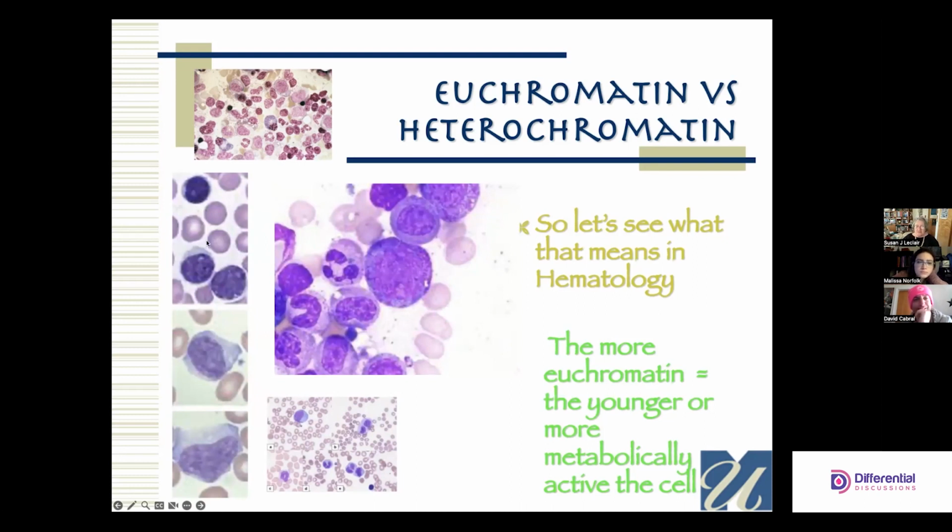The same thing is true with lymphs. When you look at these, small, round, resting. There was a time that this cell was used exclusively for size, because it's about 7 microns in diameter, maybe a little bit larger, so the nucleus is, but this one in particular is about the size of a red cell.